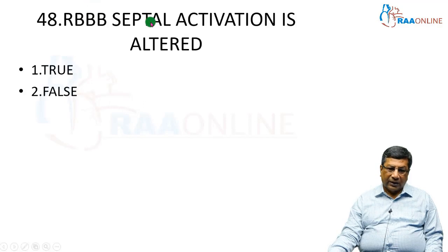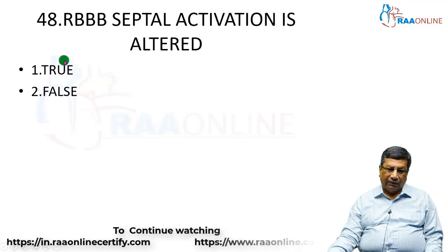In right bundle branch block, septal activation is altered. So I am asking you whether this statement is true or false. In right bundle branch block, normal septal activation is done by the left bundle from left to right. In right bundle branch block, the left bundle is not affected. So the left bundle continues to do its normal septal activation from left to right, resulting in a small R wave in V1 and a small Q wave in V5, V6. So in right bundle branch block, septal activation is not altered.